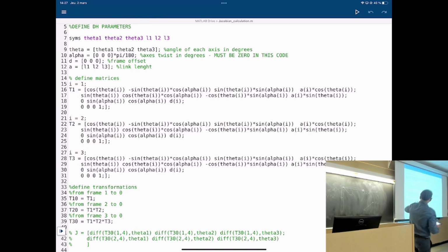Remember? It's simply the DH parameters. I'm assigning specific DH parameters that will match the robot, doing the transformation matrices, calculating them, and then from here we can extract expressions for x, y, and z. One difference: notice that in line 7, thetas are not given any values.